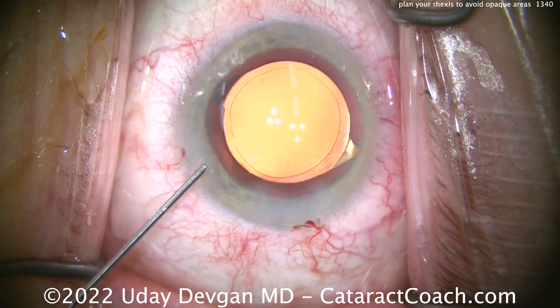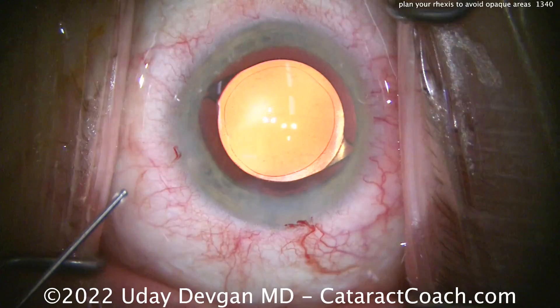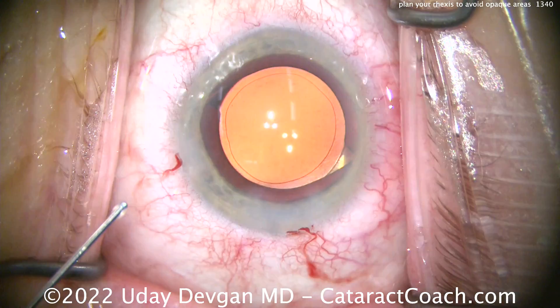Could you make a smaller rhexis? Yes — find your own happiness. If you like a 4.5 mm rhexis, do a 4.5.